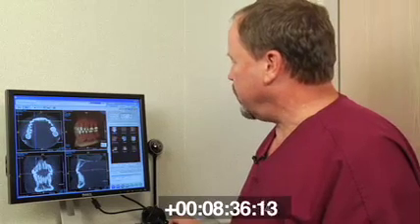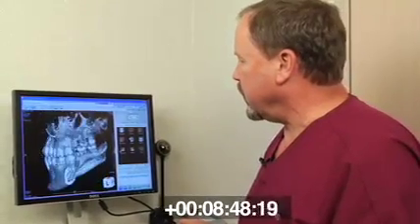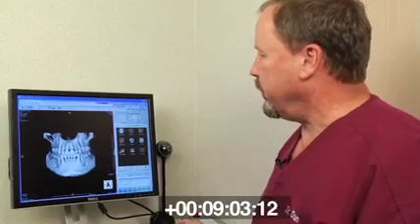We can change the templates to maximum intensity projection. We're able to go through and give a cursory look very quickly and see what things look like. We've got little cheat buttons for anterior, posterior, head, foot, right, left. So if you do get lost in space and time here, if you click one of these, you'll be right back to the home base. There's magnifying tools. There's all kinds of features that you're able to use instantly as soon as the scan is done. So that's one reason I like Prexion so much.